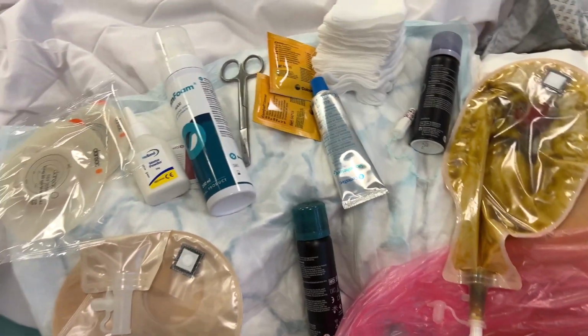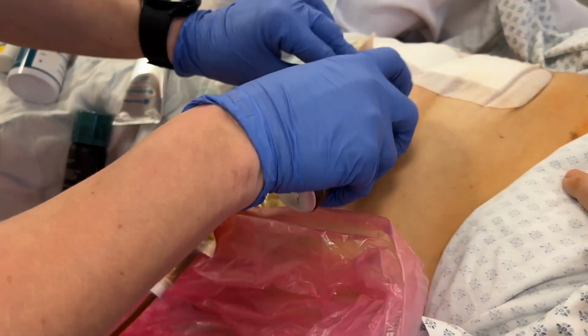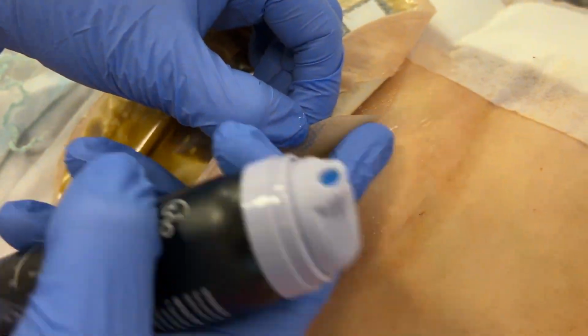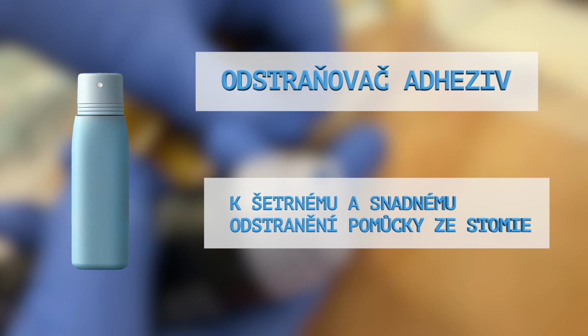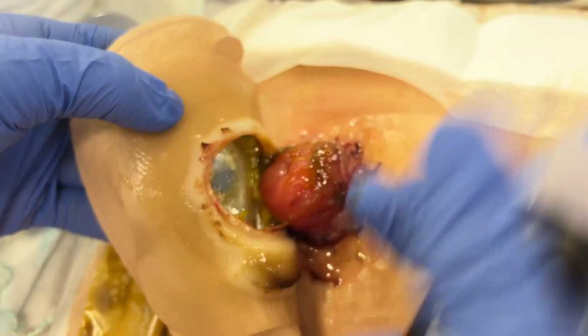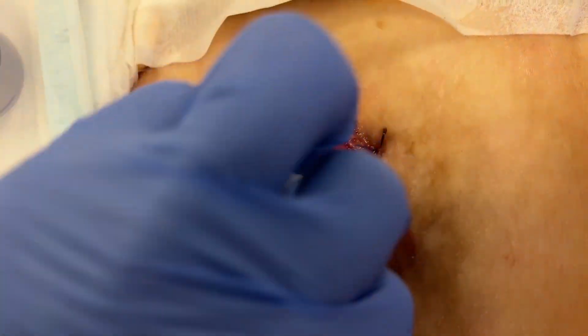Terminal ileostomy care. Stoma care does not require a sterile technique but involves specialized equipment. The removal of the existing appliance should be done using an adhesive remover to facilitate gentle detachment. A cleansing wipe or stoma foam is used to clean the stoma and its surrounding area.